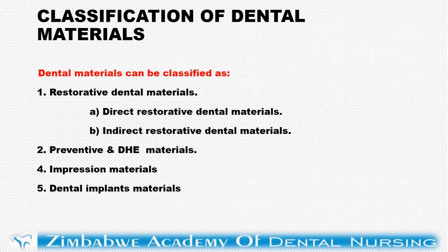Then after fabrication, the artifact or the product is brought to the dental surgery, where the dental therapist and the dentist can then apply or attach it to the tooth or to the teeth, such as bridges, onlays, inlays, post and cores, veneers, even dentures, etc., etc. Number 2, preventive and dental health education materials. These are materials such as floss, dental floss, toothpicks, interdental brushes, plaque disclosing tablets and solutions, and many others.